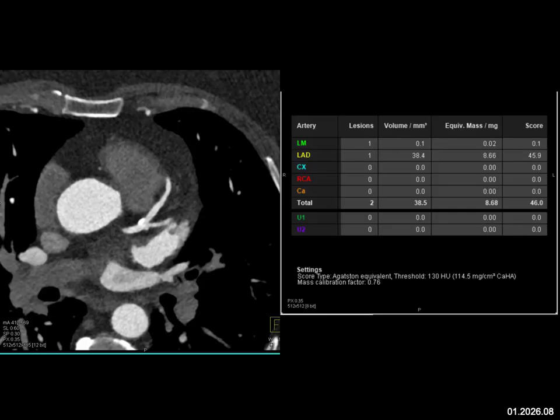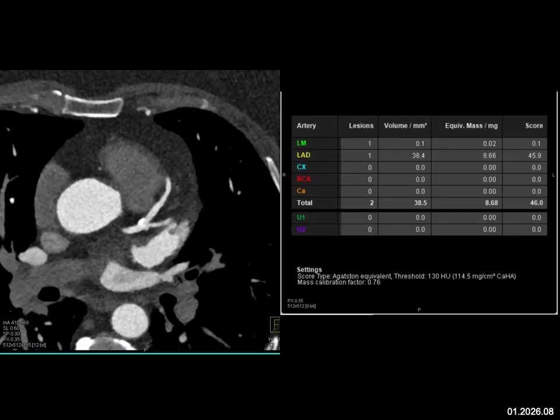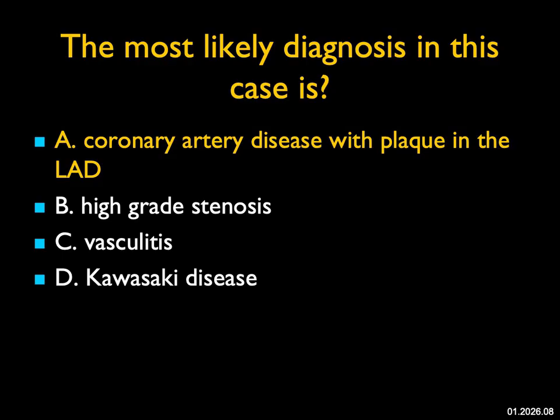The most likely diagnosis in this case: this is part of a CT angiogram. You can see the left coronary artery and a calcified plaque. The calcium scoring on the non-contrast scan shows calcification only in the LAD, with an Agatston score in the 40s. The calcification is eccentric, so this is not a high-grade stenosis. It's atherosclerotic disease — not vasculitis and not Kawasaki's disease. This is classic coronary artery disease with a plaque in the LAD. Remember, calcium scoring tells you the amount of plaque present, but for vessel stenosis you need a coronary artery CTA.